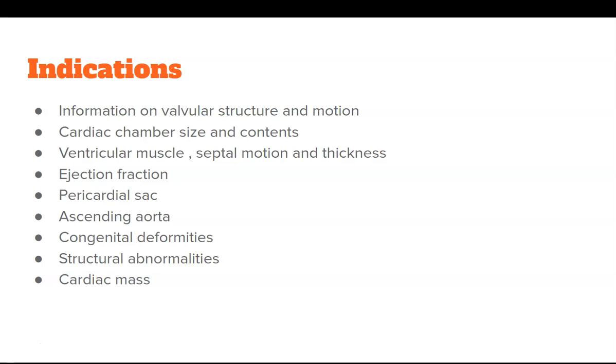Next is the ventricular muscle. The thickness of the ventricular muscle, especially in cardiomyopathy or heart failure patients, we can measure with the help of echocardiography. Septal motion is the same as valvular motion, and you can make out the thickness of the valves.